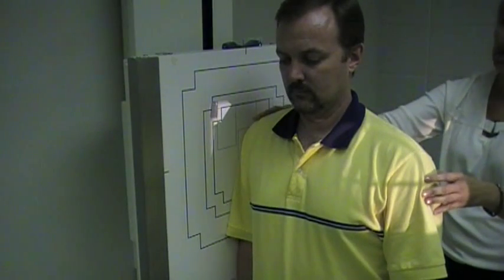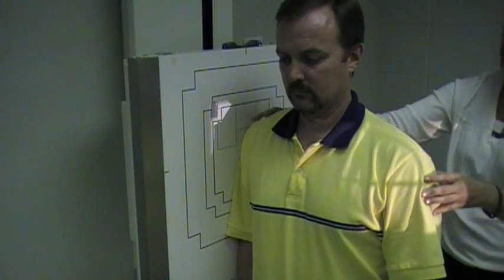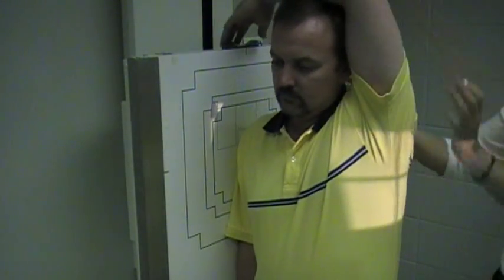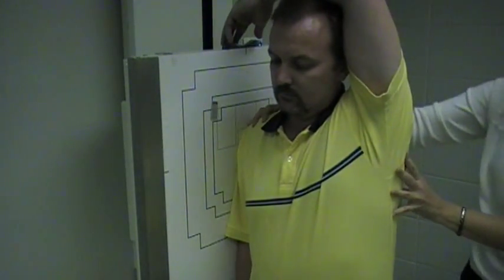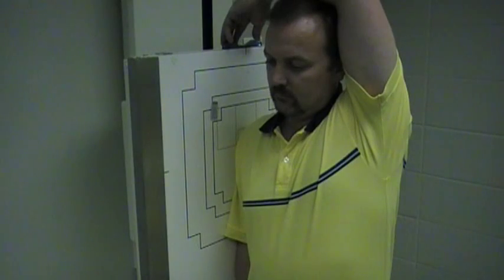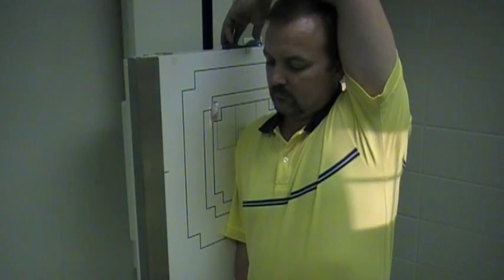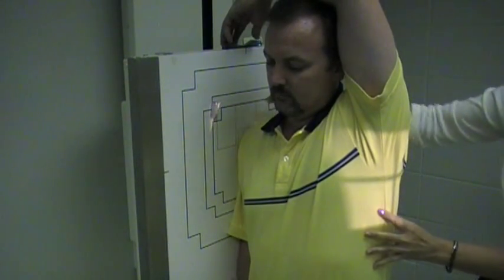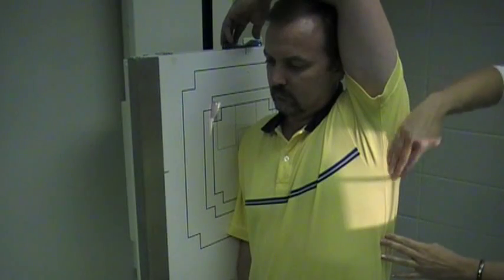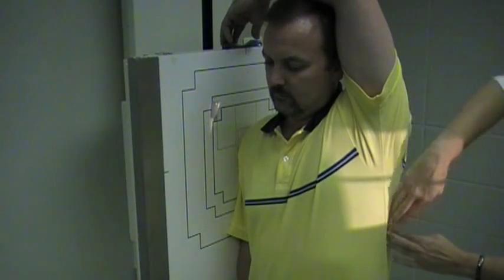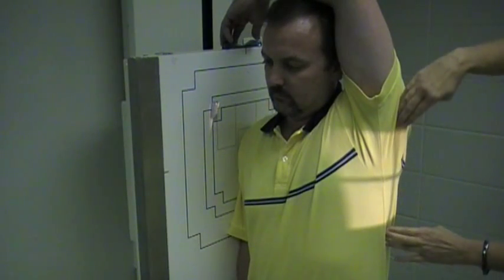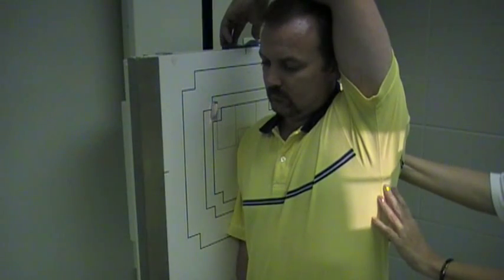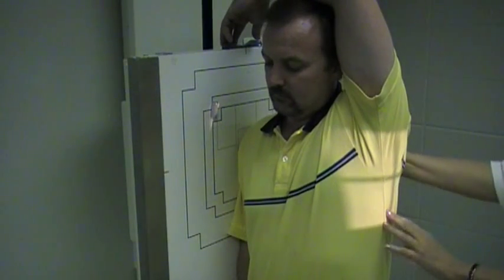This is our affected arm, the right arm. I'm going to have the good arm raised over the head, and we'll be shooting this projection through the patient's chest. Just get your patient lined up so that your central ray is going to be hitting mid-coronal, just to make sure the patient's good and straight and lateral for this.